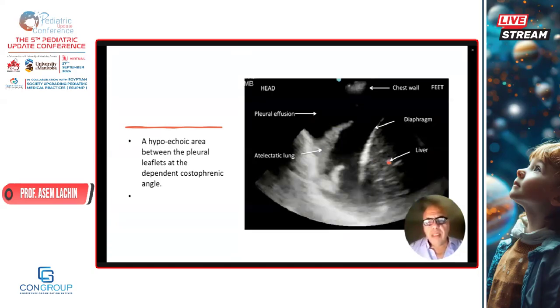But in this summarized module of the lung ultrasounds, we can find it by the longitudinal sweeps, as we mentioned, especially on the lateral sweeps on the right and the left side, from up to down, and you can find it down in the costophrenic angle.